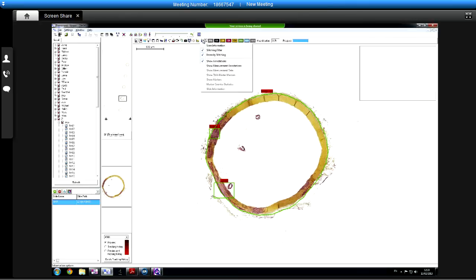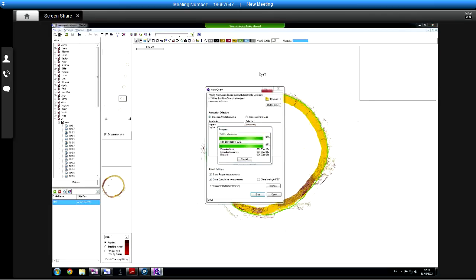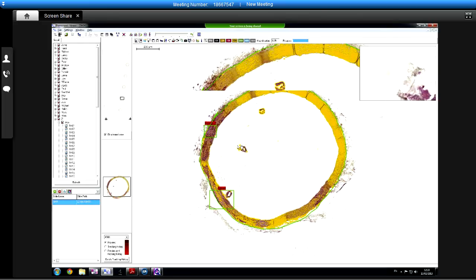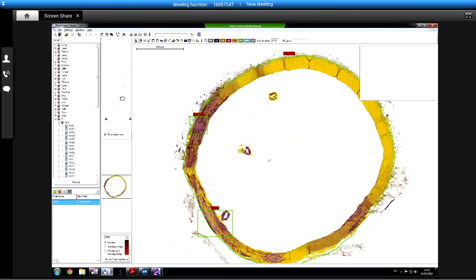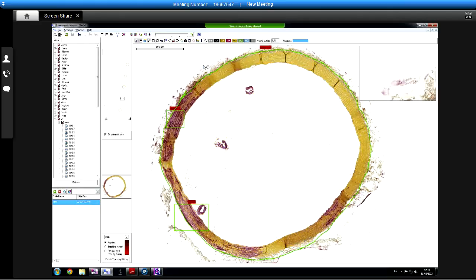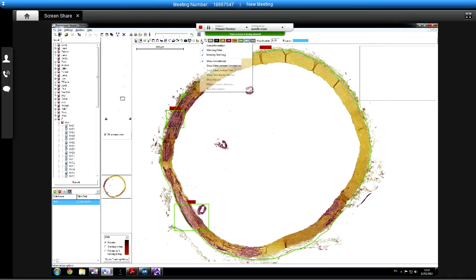Yeah. It's a shame. In fact, it seems to have done almost the opposite of what you wanted to do, doesn't it? So this is all fault. This is all negative, isn't it? This is negative. This is negative. That's another way to look at it.